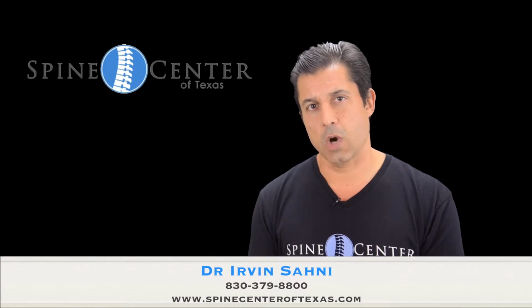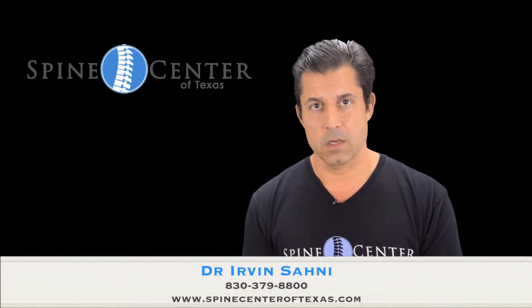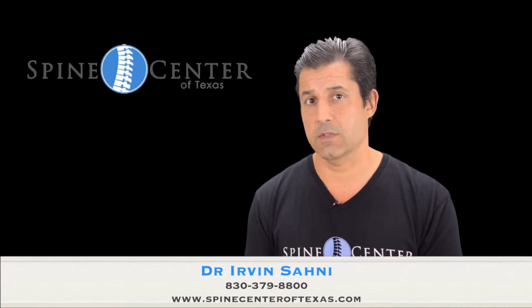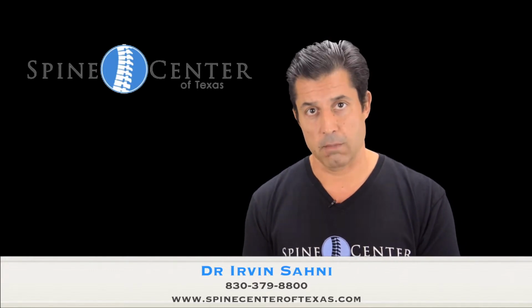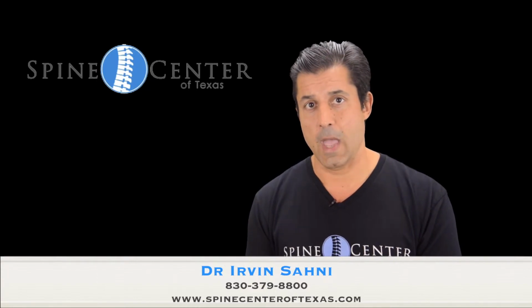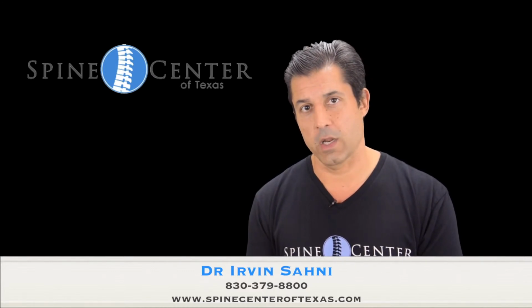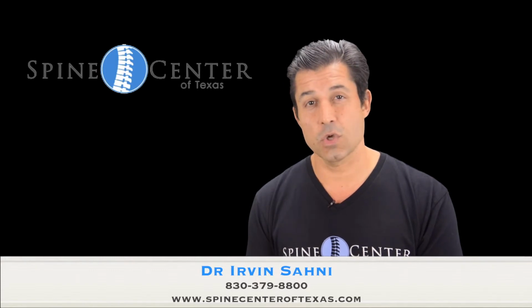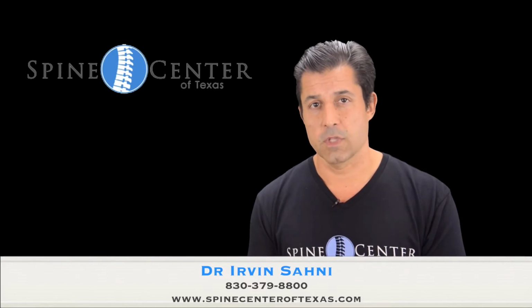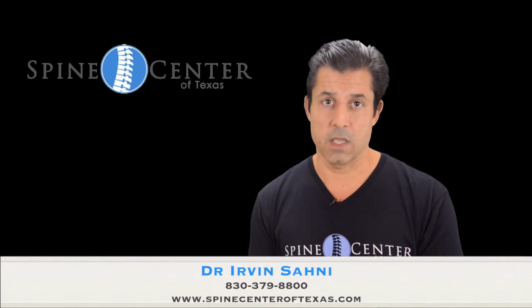Dorsal column stimulation operates on something called the gate theory of pain. Basically, the way to think about it is that the dorsal columns, or this very specific portion of your spinal cord located on the backside of the spinal cord, is responsible for pain. And by placing a low voltage electrical charge at the end of a wire in the epidural space in contact with that area, you simply overwhelm that area's sensory ability, and so you just don't perceive the pain. It can sometimes result in a low-level buzzing, but this low-level buzzing that you feel in the legs is generally much, much more acceptable than the pain itself.